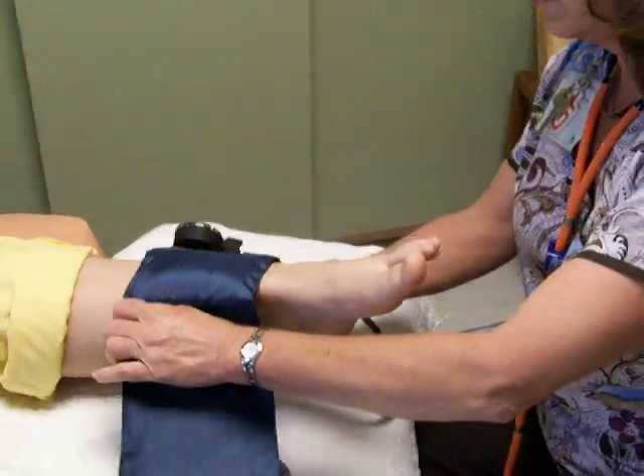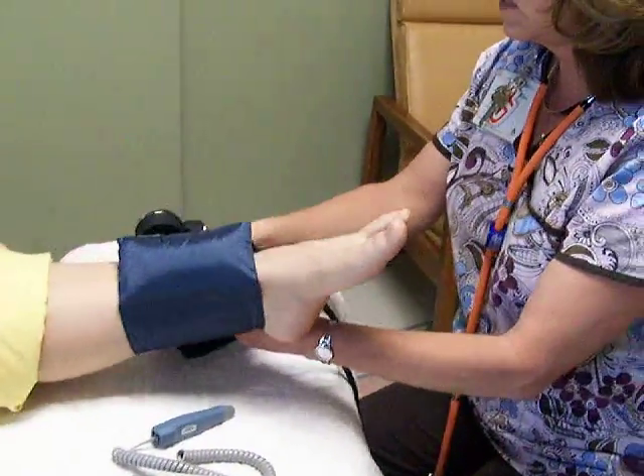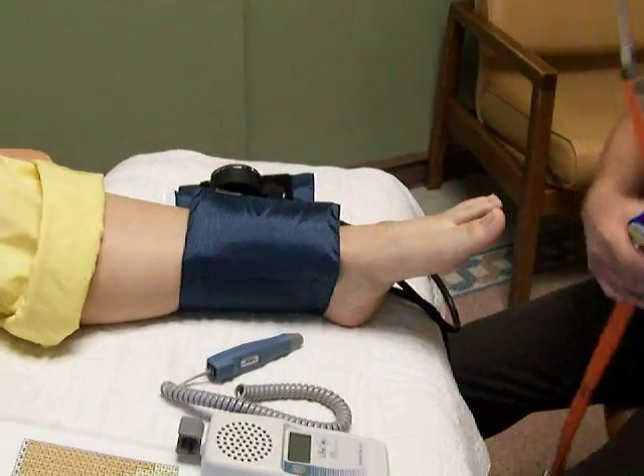Then you take the blood pressure cuff and wrap it around the ankle. If you have a wound on the ankle, it's fine to do it on top of that — just cover the wound with sterile gauze and then wipe the cuff off afterward.